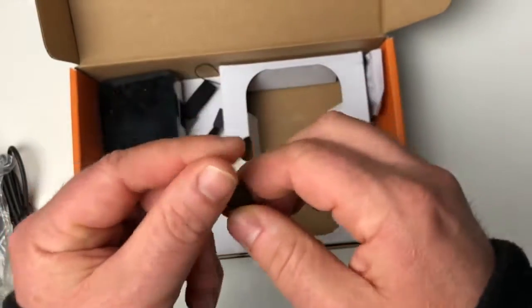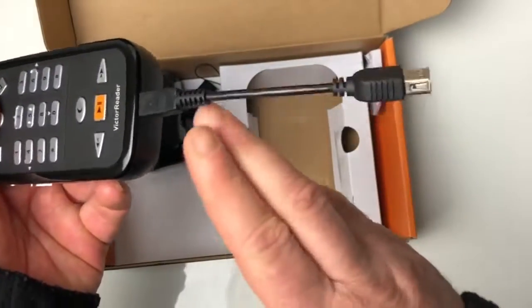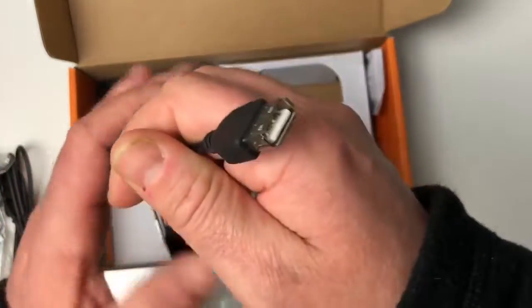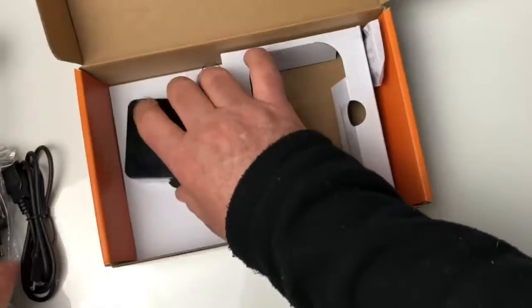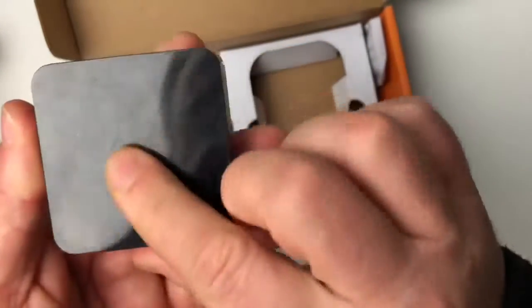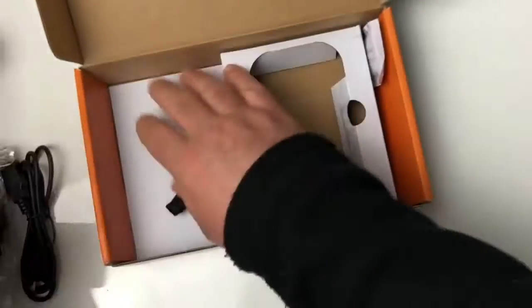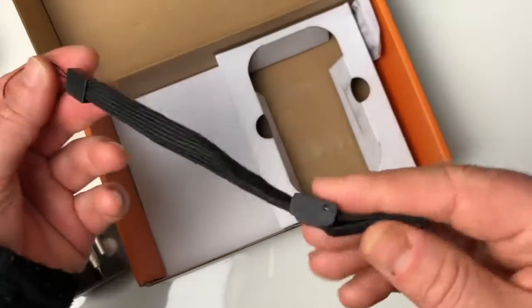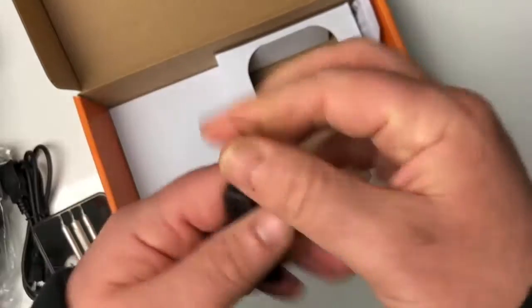On va le faire tout de suite. On a branché le micro USB dans l'appareil, et on peut voir que si on met une clé USB ici, on va pouvoir échanger des données entre l'appareil et la clé USB — c'est vraiment très bien fait. On a également des écouteurs intra-auriculaires dans une boîte en plastique, avec un port jack classique. Et on a une petite dragonne que l'on pourra mettre à son poignet lorsqu'on se promènera avec le Victor Reader Trek.